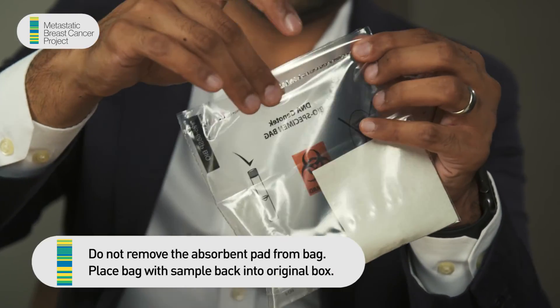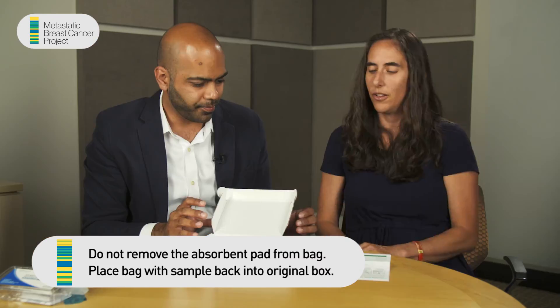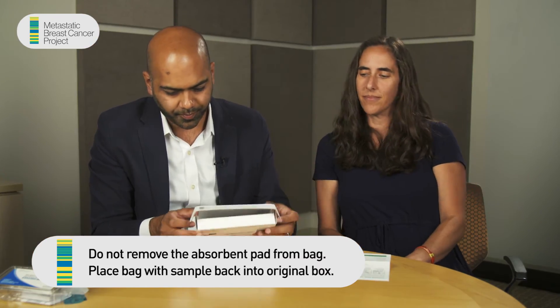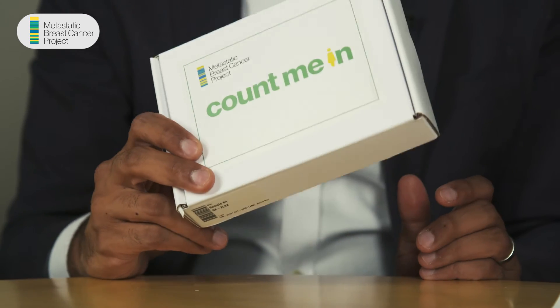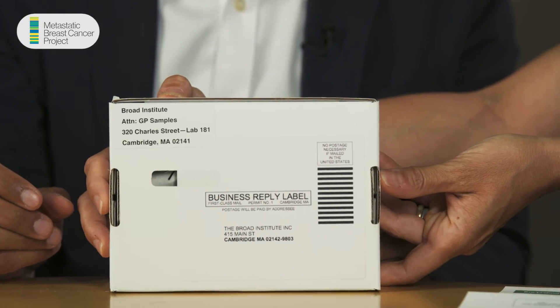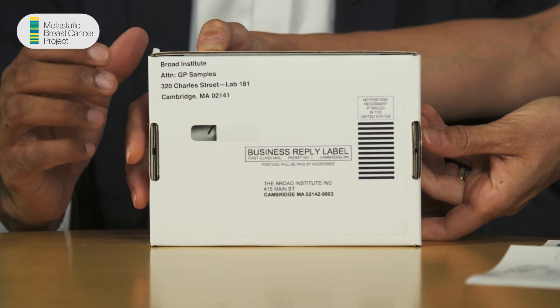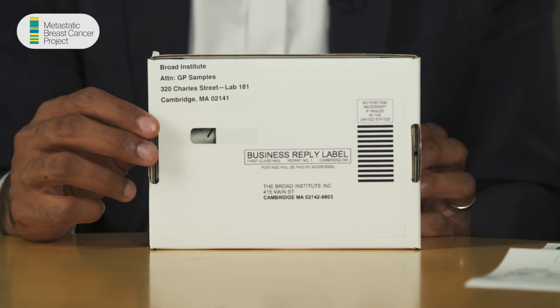Now you're going to put that whole thing into this biohazard bag, close it up. Now can I just pop this in the mail? You sure can — look at this, we have prepaid postage on the back and it's self-addressed back to the Broad Institute. Just put it in a regular mailbox. We want to thank you for participating in the MBC project — thanks for doing this and thanks for all your feedback.